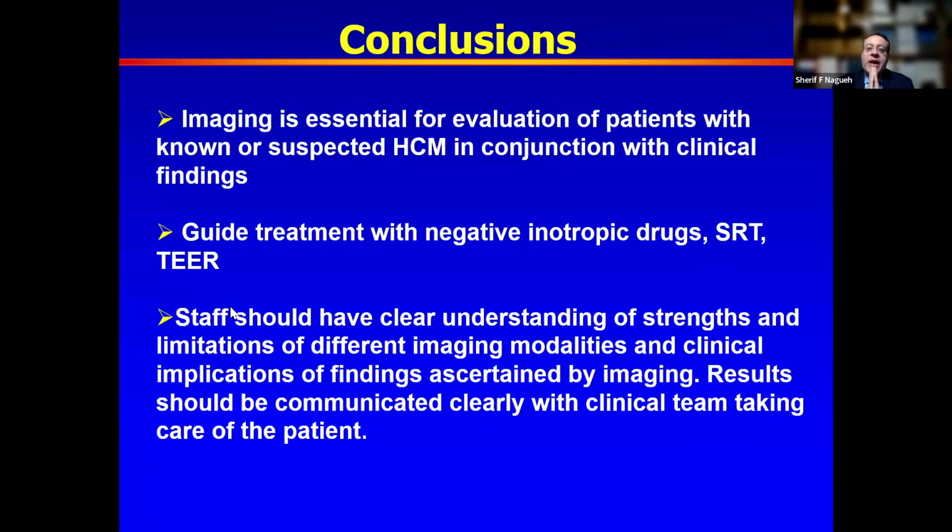Another thing, if you have a patient struggling with the Valsalva and they can do squatting to standing, this is very effective and can result in similar or even higher gradients. That's another available option for the sonographer scanning the patient. That is challenging, squatting to standing.